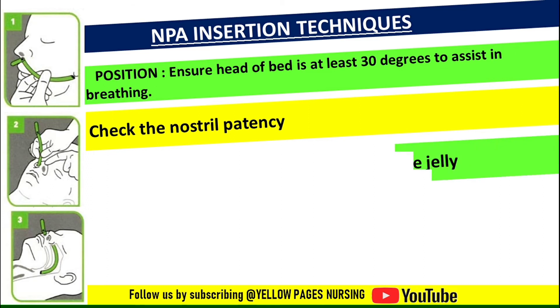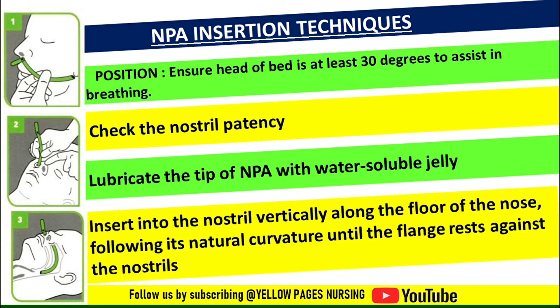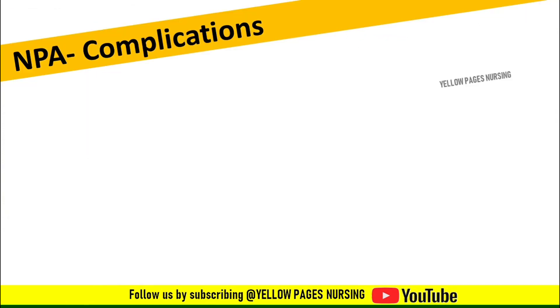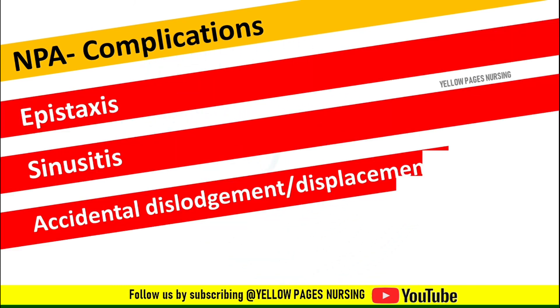Lubricate the tip of the nasopharyngeal airway with water-soluble jelly. Elevate the tip of the nose with a finger, then insert the nasopharyngeal airway into the nostril vertically along the floor of the nose, following its natural curvature, until the flange rests against the nostrils.